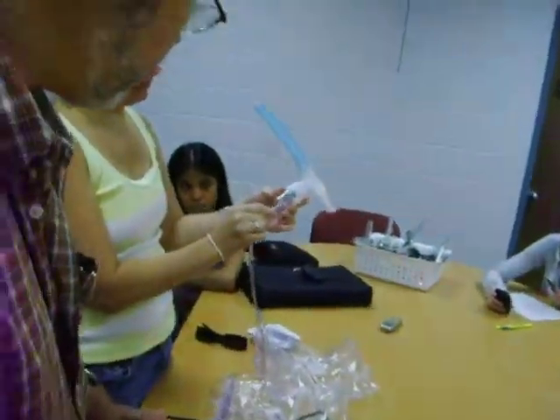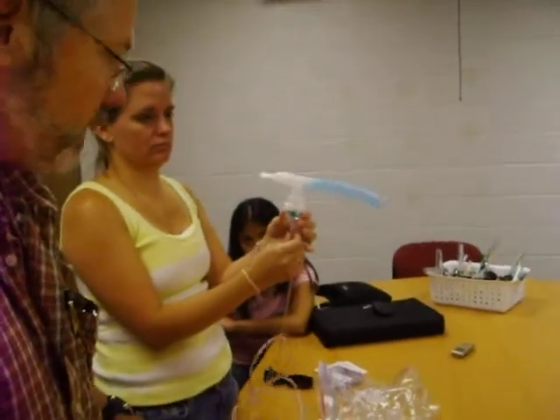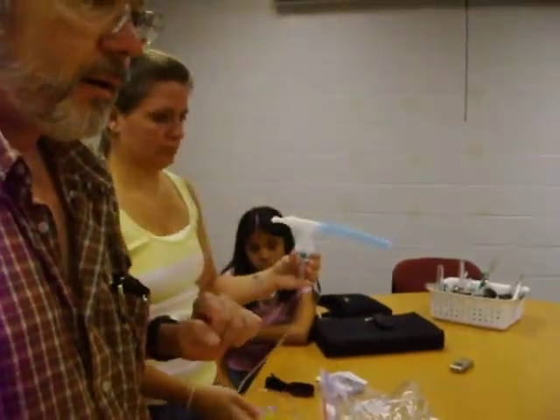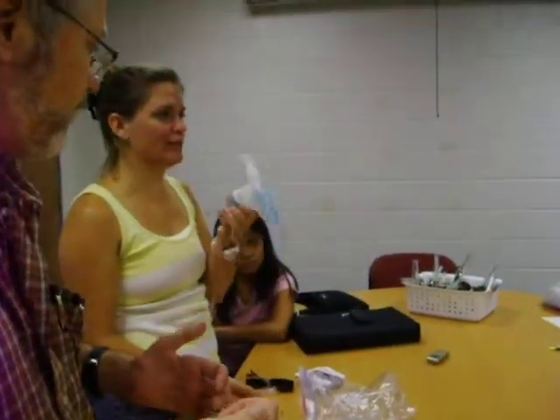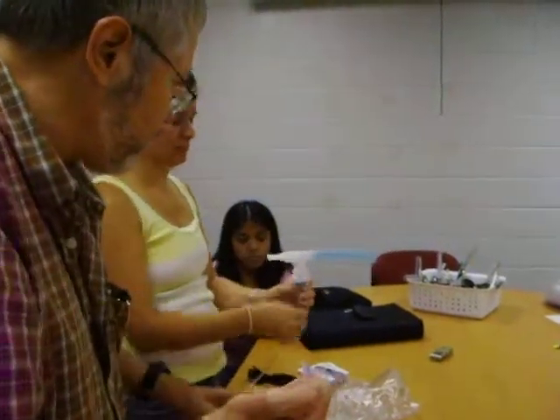Is this what we're going to have to do for the proficiency? Yes. So we're not going to use the mask? You can use the mask or the mouthpiece — it's either way, because you can prop it in the mask or in his mouth and it stays there. It's at an angle, or you can put the mask on. If you're going to do the mask, let's do the mask and show you how you do that.